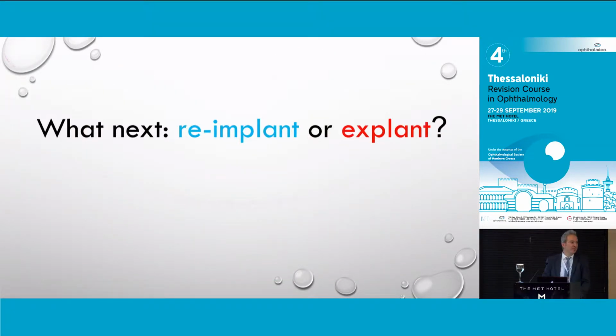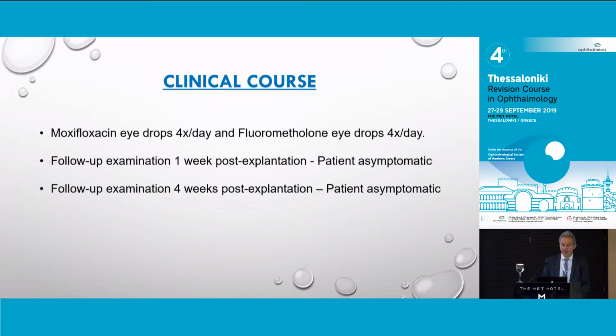So now that you have more information, what would you do? Reimplant or explant? So, no answers to the question. So what I did, I explanted the ring. And the clinical course was the following.